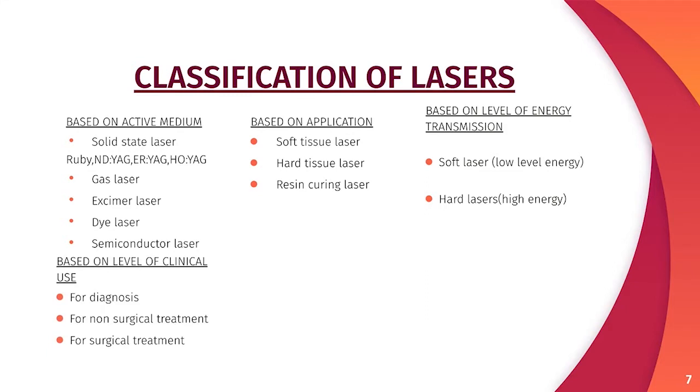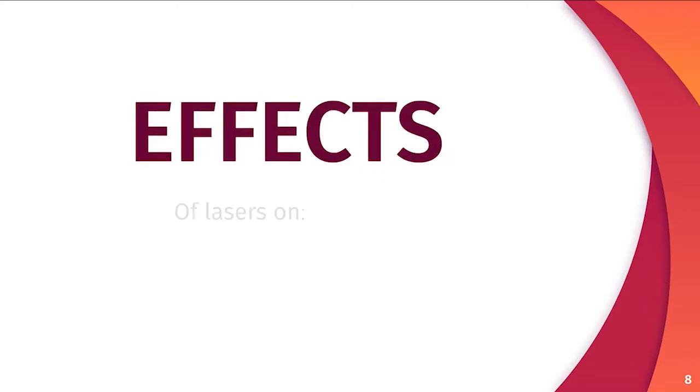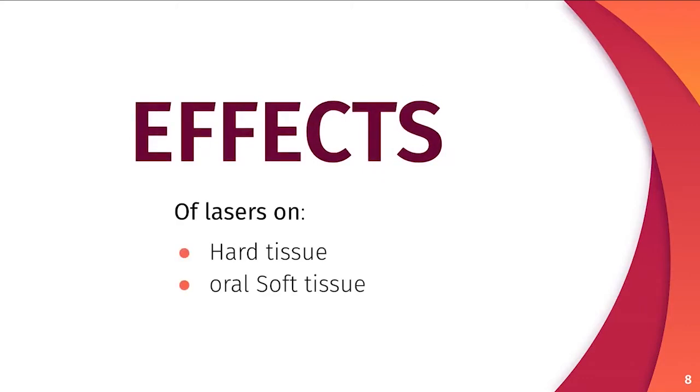Based on level of clinical use: for diagnosis, for non-surgical treatment, for surgical treatment. And based on wavelength, these are carbon dioxide, Nd:YAG, argon, excimer, holmium YAG and erbium YAG laser. Then we will see the effects of lasers on hard tissue, oral soft tissue and pulp tissue.